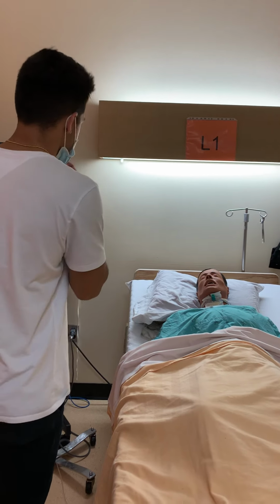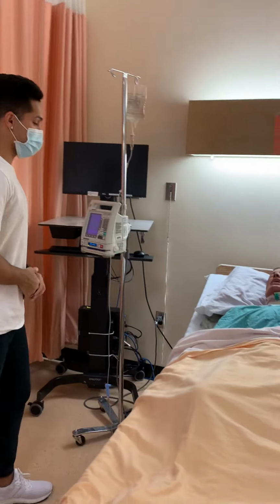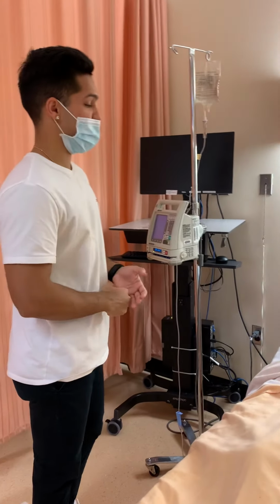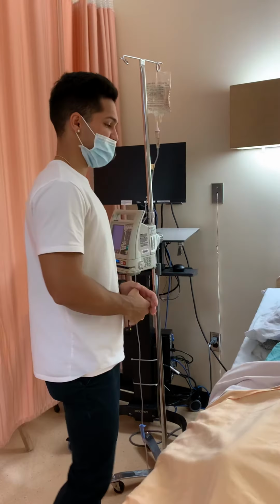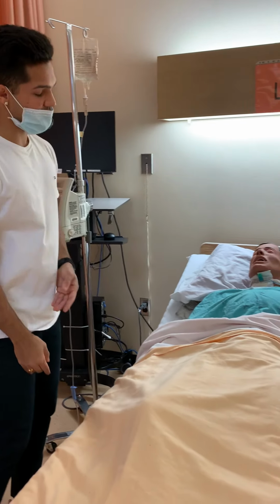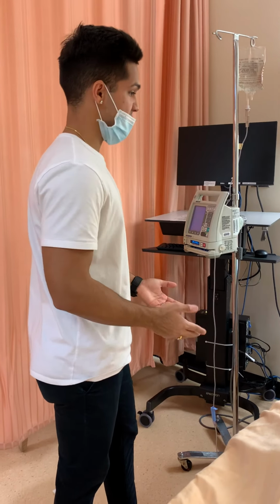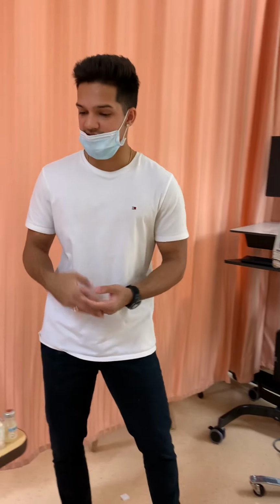So if you do experience any of those, please use your call bell and call me. I'll be here to further assess you as soon as possible. And before giving this medication, I'm going to be doing full vital signs, and everything is good. Everything is in a good range for me to give this medication. I'm also going to be assessing your cellulitis on your left arm. The patient has given me consent for the medication.